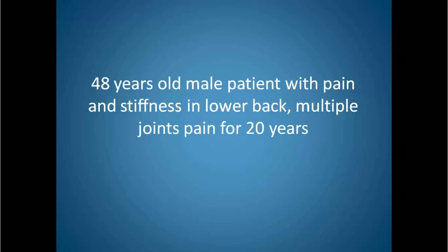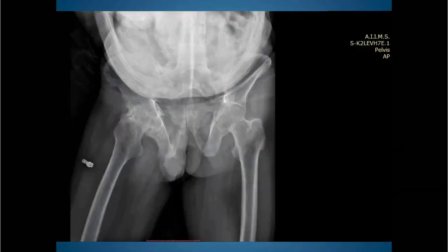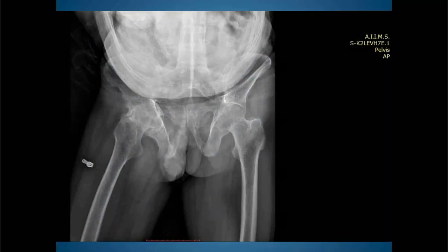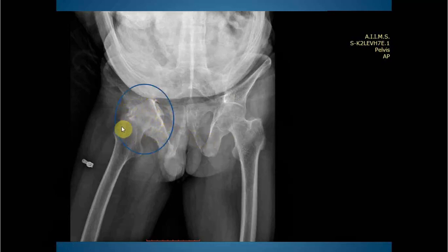Let's start with a case. This is a 48-year-old male who presented with pain and stiffness in the lower back and multiple joint pain for 20 years. This is the AP radiograph of the pelvis. We can see there is decreased bone density, osteopenia involving almost all the bones visualized, and bilateral protrusion acetabuli. There is bony ankylosis involving the right hip joint.